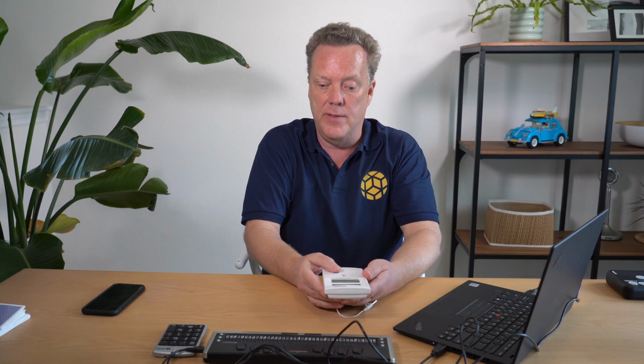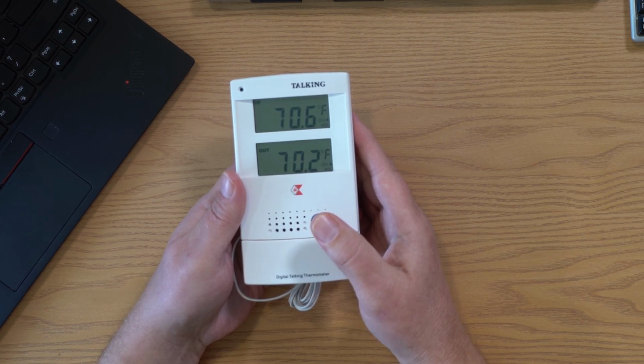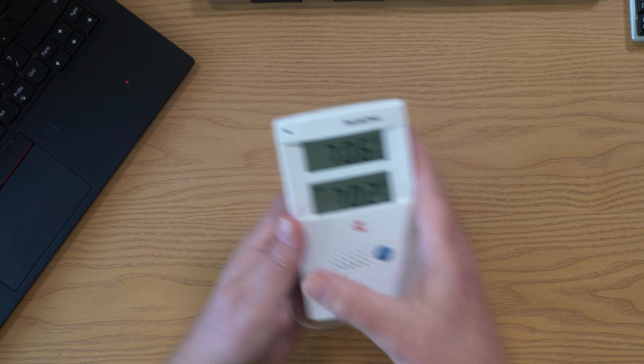There goes my phone talking. Let's turn that guy off. Screen locked. And what else? Okay, here's something. This is a thermometer, and it's a talking thermometer. So if you can see that, there's a button here I press, and we'll hear. The indoor temperature is 70.6 degrees Fahrenheit. The outdoor temperature is 70.2 degrees Fahrenheit. All right. Just an example of something that talks for me.